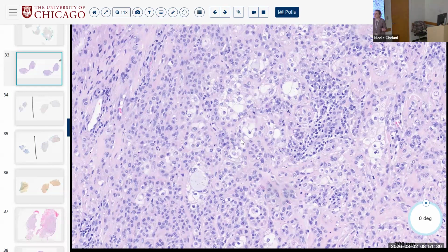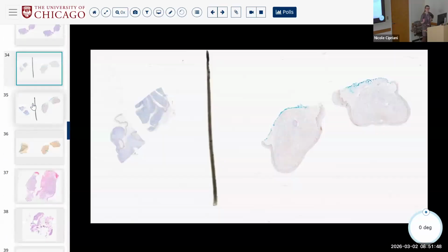Question mark? I don't know. Is that a duct? Is this a mucinous cell? Not sure. I think hyalinizing clear cell carcinoma, I think a clear cell myoepithelial carcinoma, and I think a solid mucin-poor mucoep are all on the differential. The problem is, what do all of those stain for? What should all of those stain for?